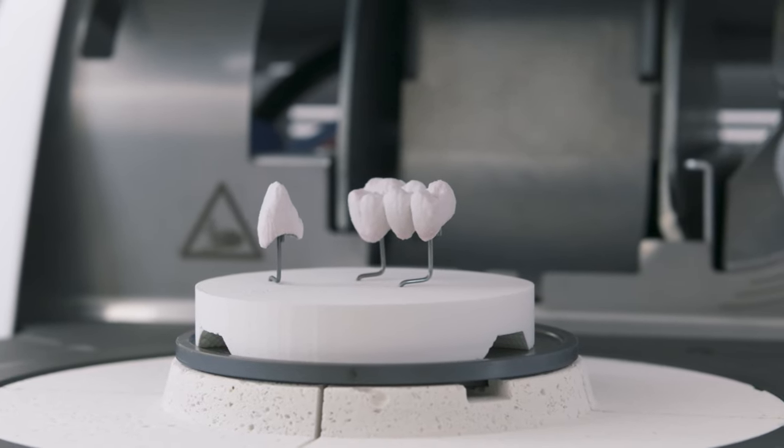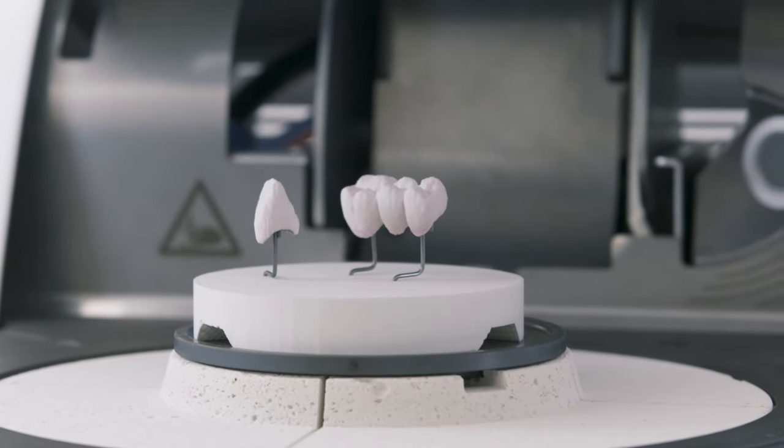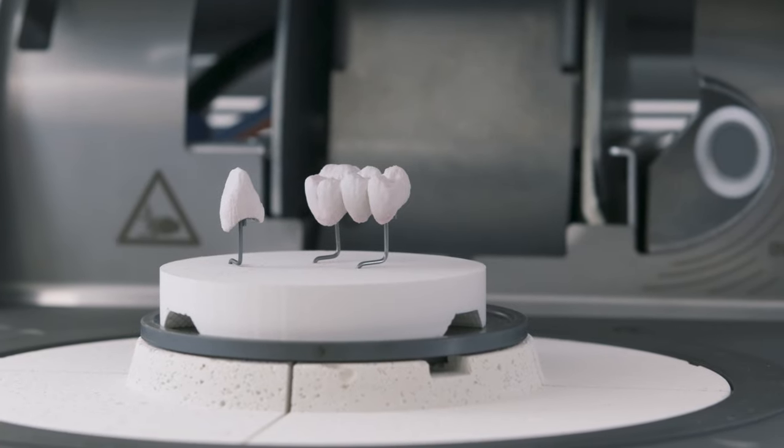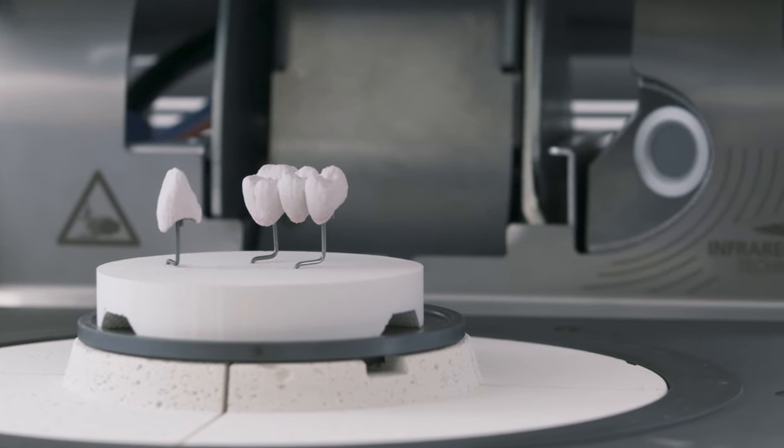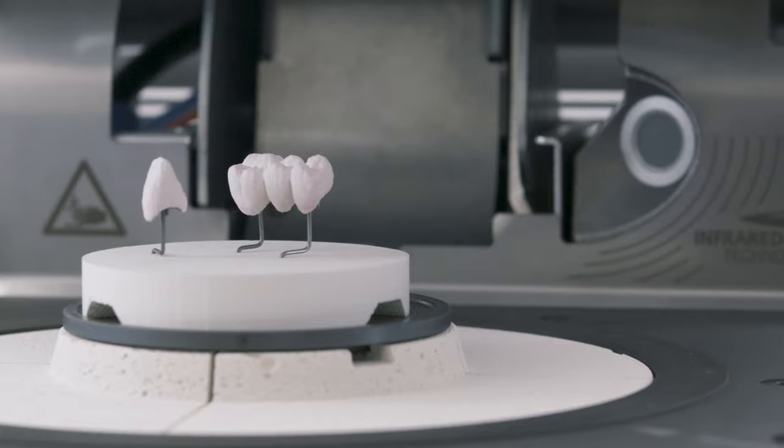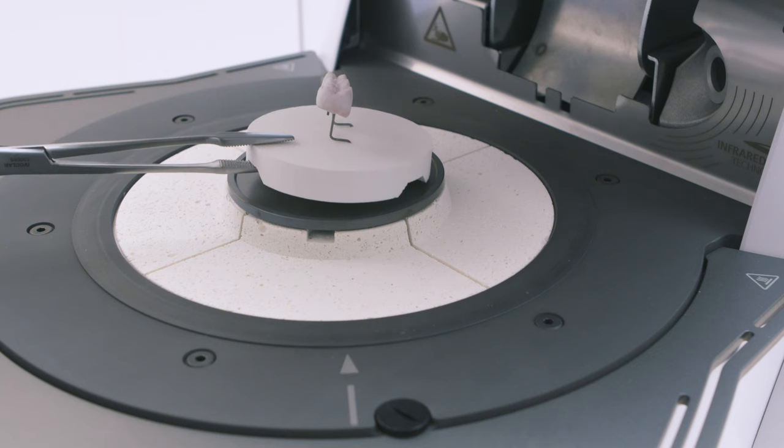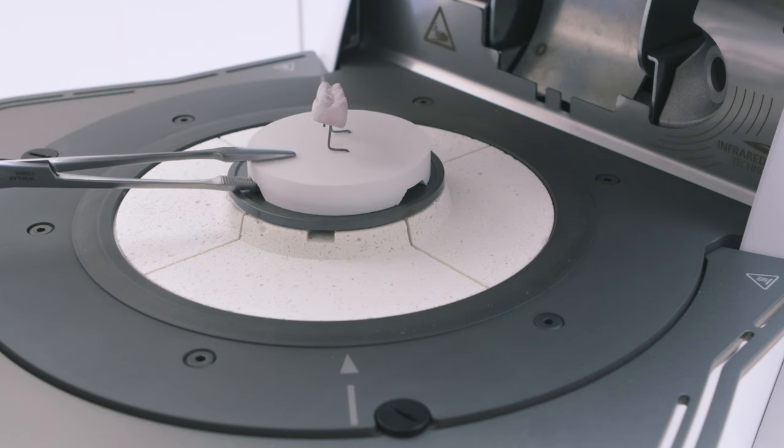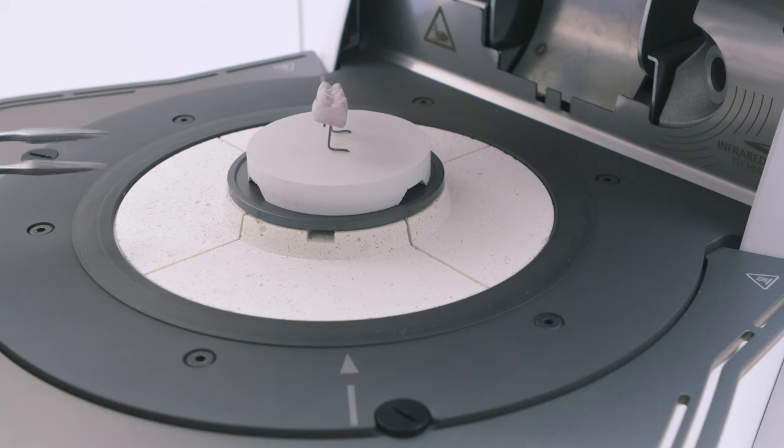If you want to fire several objects together, position the firing tray in such a way that the camera can measure the temperature on the large and bulky objects in particular. Likewise, position wet restorations in such a way that the camera can easily catch them.